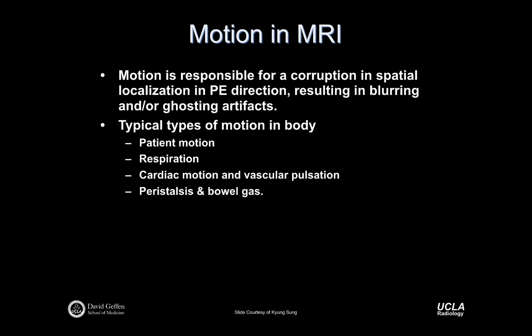Respiration is quite periodic, right? And there are lots of MR-based methods, lots of instrumentation-based methods for monitoring respiratory motion and trying to either synchronize the imaging instrument to a state or phase of respiration, that's probably the main way. So somehow track the respiratory motion and synchronize imaging to particular states.